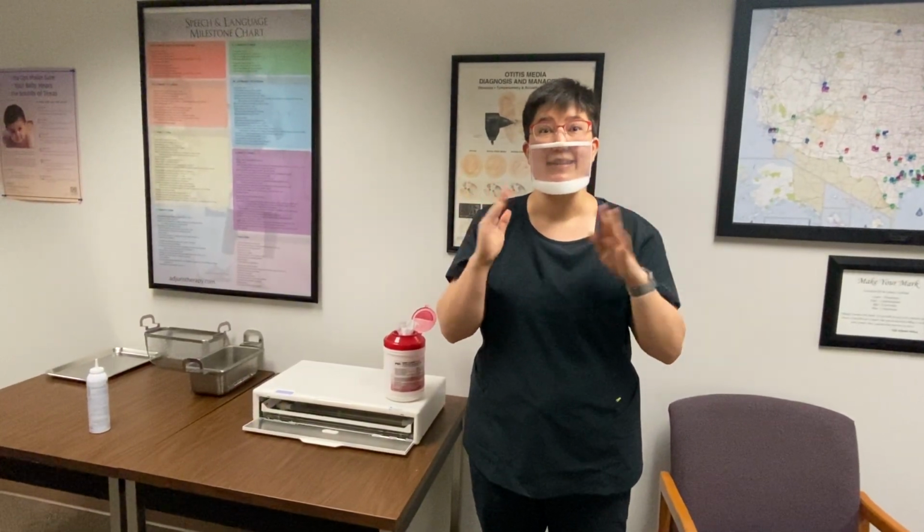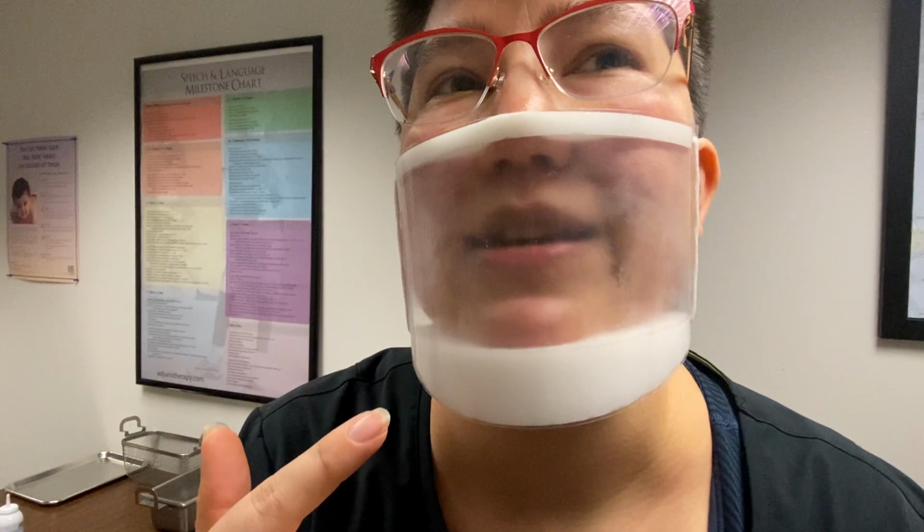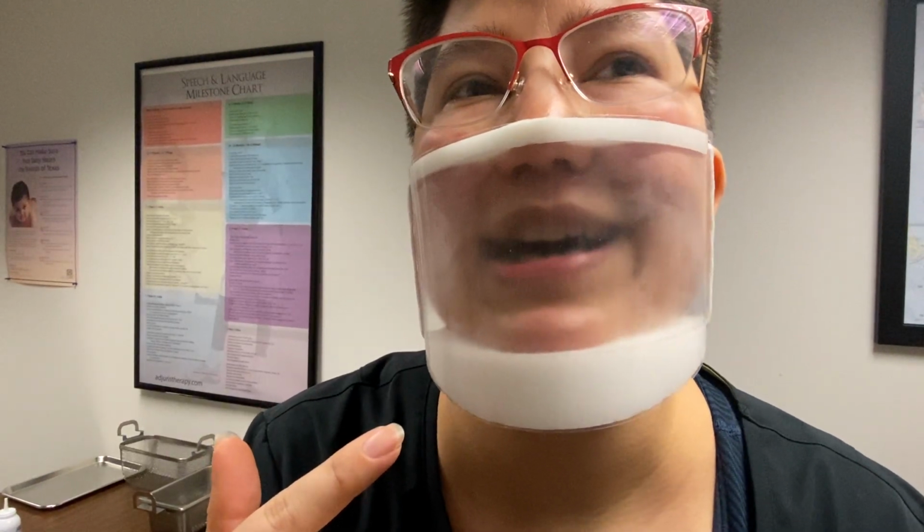Now, I'm gonna get the close-up point. Look at the mask. See how it's all looky, yucky, spitty? Over time, that's a problem. So, how do we get these off and how do we clean them? Because yes, they're single use, but they're also $60 a box for 24 of them. And it took me like 3 months to get 2 boxes. So we are going to reuse these as long as we can or until we can make some more.